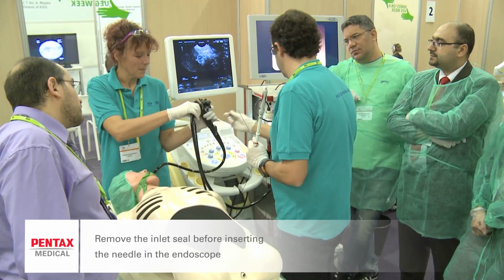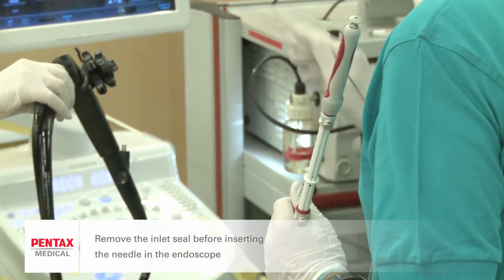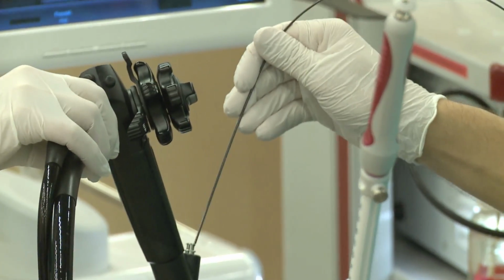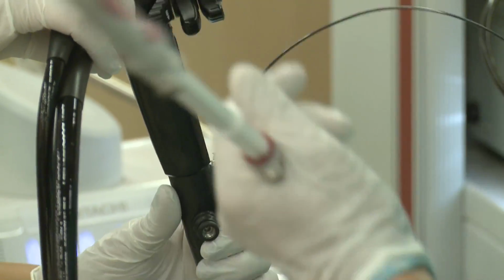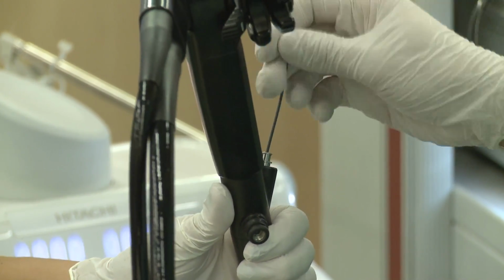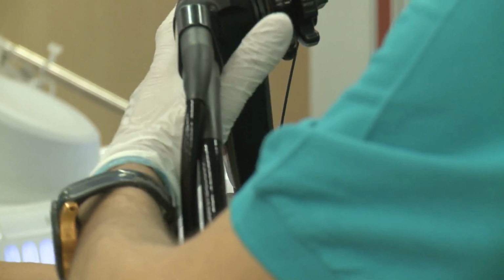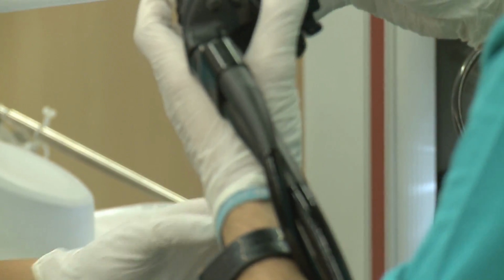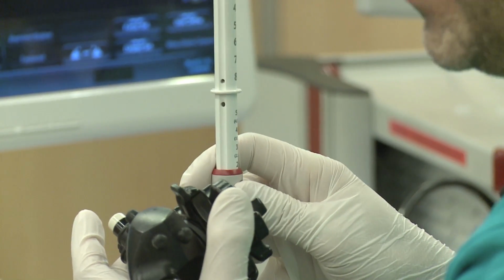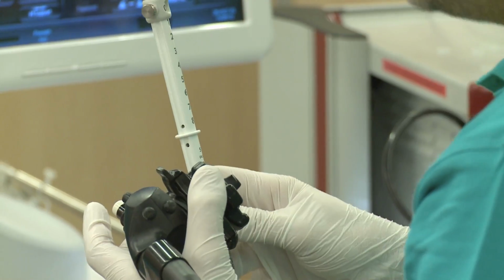Okay, so you see that if we have a very straight position, it's very difficult to lose the position of the lesion, and then we need to go. Now if the scope is bent, I can also introduce the needle? As much bended it is, as much complex is for the needle to go out, and to make something unsafe. So better get it out and put the needle and then?